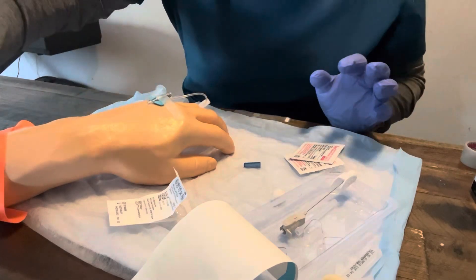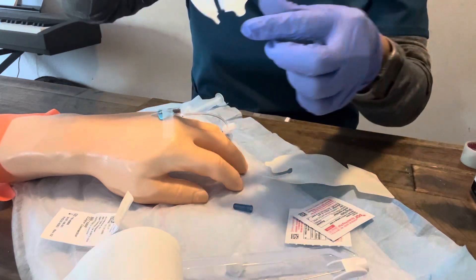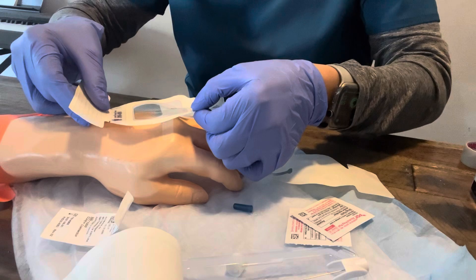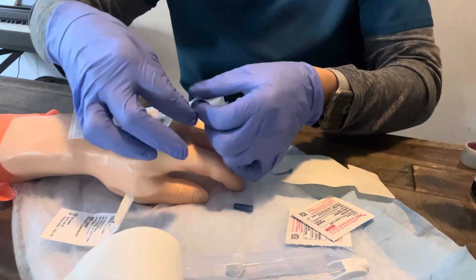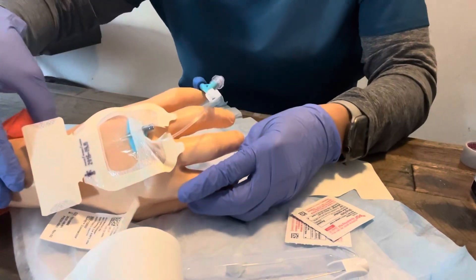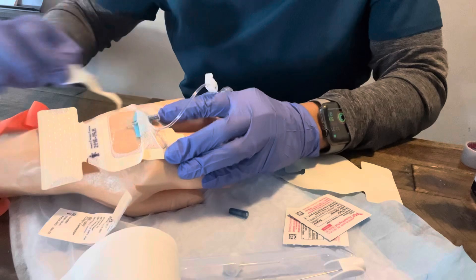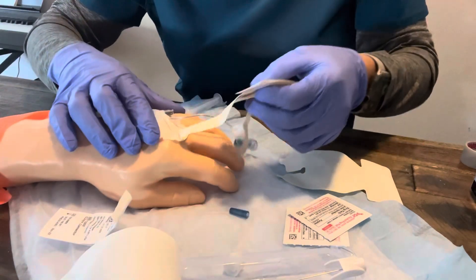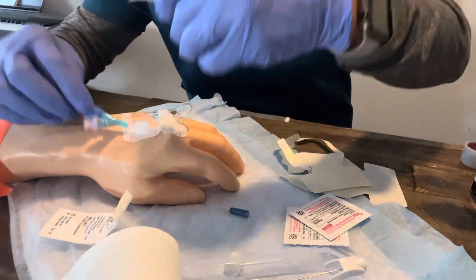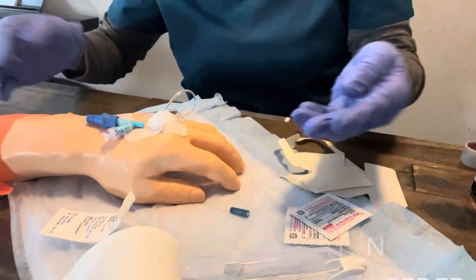Now I'm ready to put my Tegaderm on. I'm going to place my Tegaderm right over — you can see a little window here. I'll place the Tegaderm over the site, put my little catheter label in here. As you can see, I've got a little window where I can see how the site looks. Everything looks good and flushes well. For extra security, I like another piece of tape to anchor the hub down so it's not flopping anywhere.